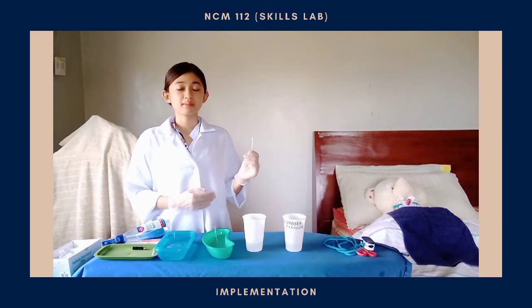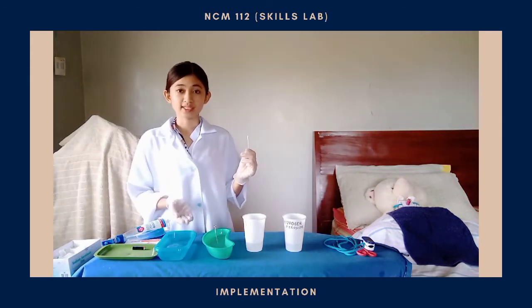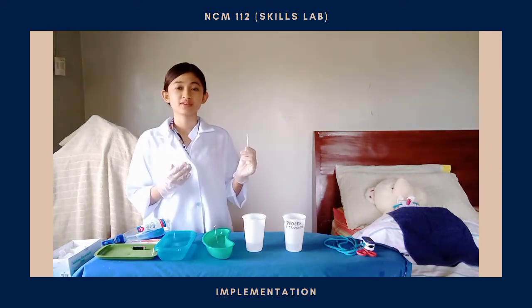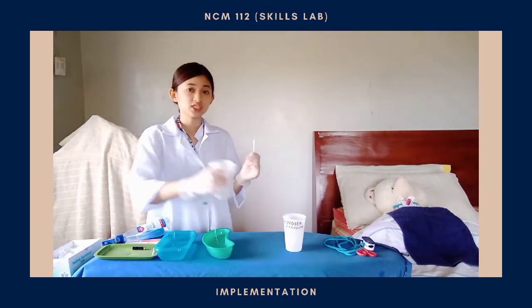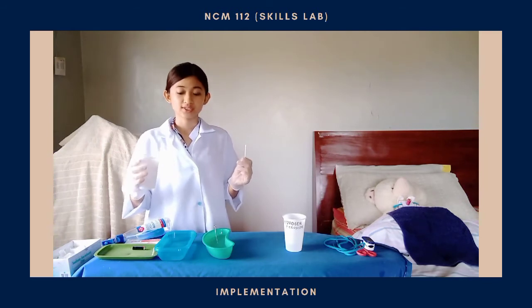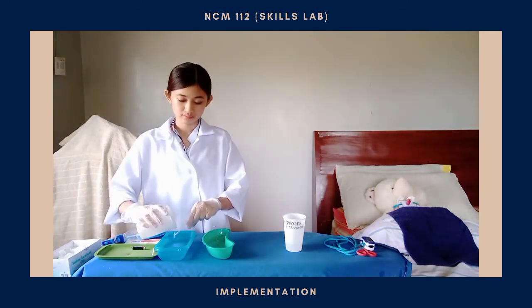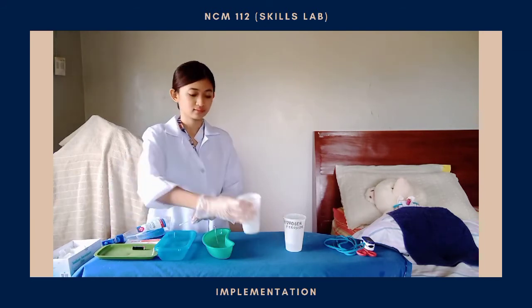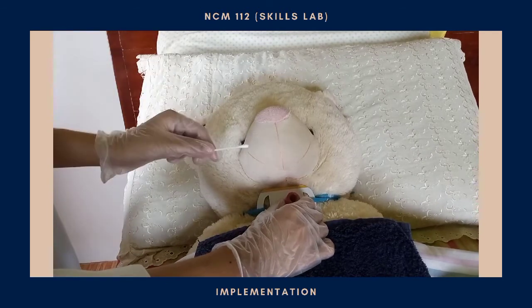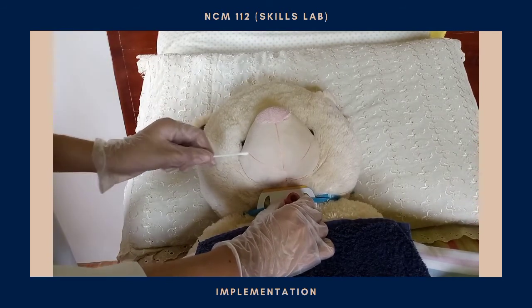Dip the cotton tape applicator or gauze sponge in a cup or basin with sterile saline. However, if we are going to use our second basin and it is already full of secretions, we can use a third basin. But if it is not available, we can just soak the cotton tape applicator with the plain normal saline solution. Stabilize the tracheostomy tube and use each applicator or sponge only once.